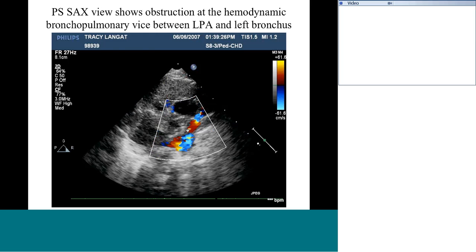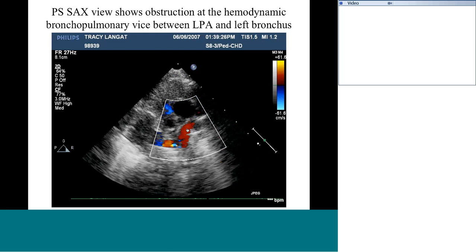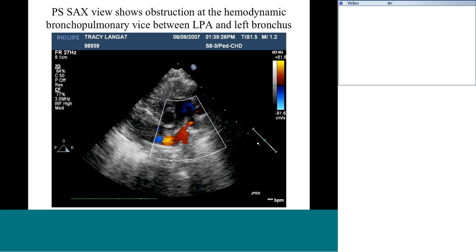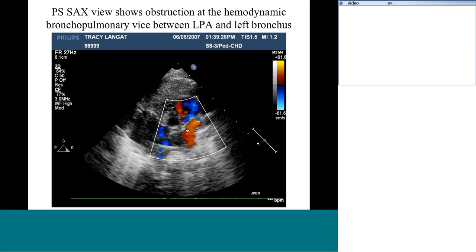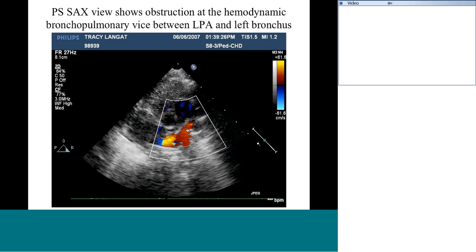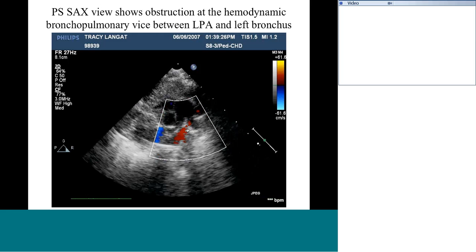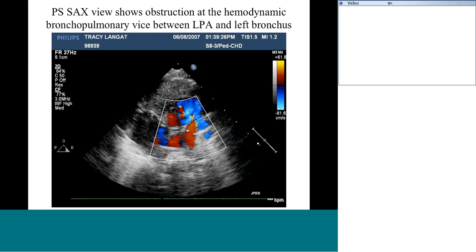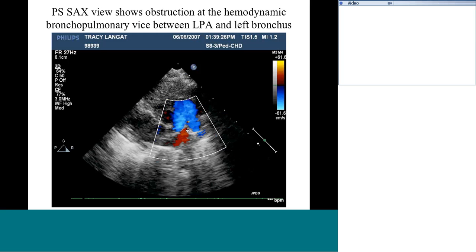This additional obstruction of the left vertical vein caused by the dilatation of the left pulmonary artery leads to more obstruction. The increasing obstruction leads to more distress for the baby, and so the baby cries more due to breathlessness. And that crying and that agitation leads to further pulmonary hypertension. And that pulmonary hypertension leads to further left pulmonary artery enlargement. So this becomes like a vicious cycle, and in that cycle, the child may die. That is the reason why an obstructed TAPVC has an extremely high mortality, and that is one of the reasons why we say the moment we diagnose obstructed TAPVC, immediately try to operate.